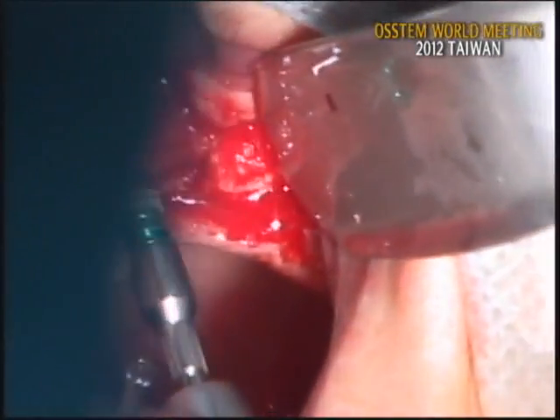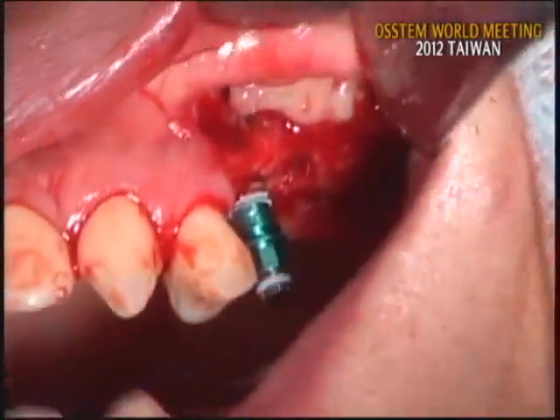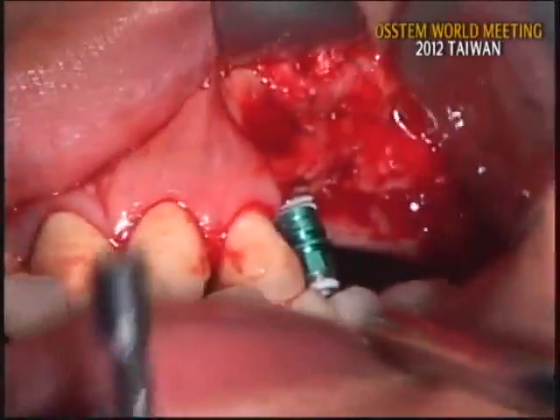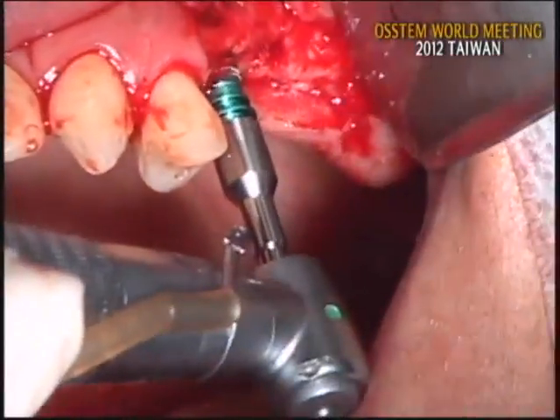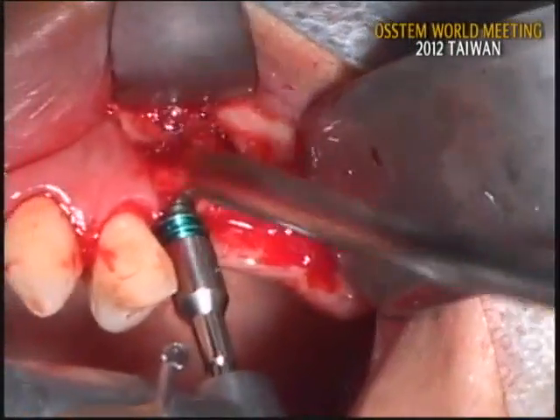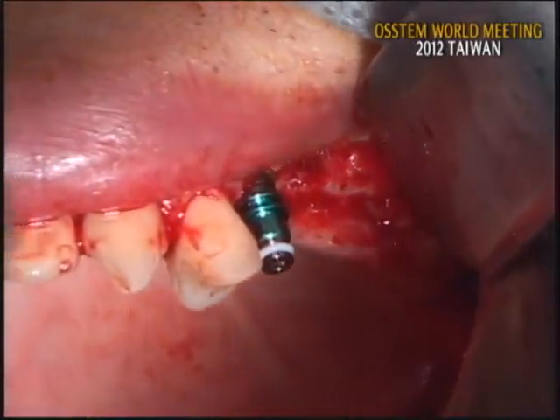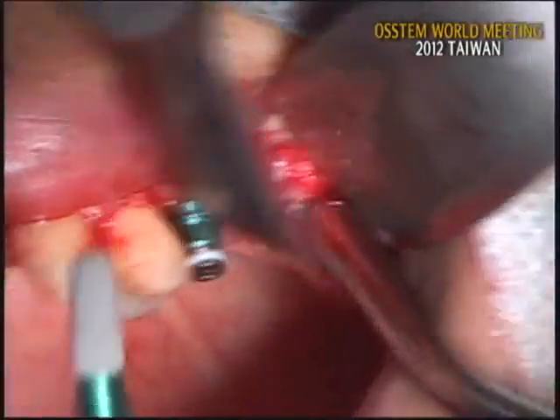Okay. Torque is not bad. Close. Okay, good. Open, please. I think torque is very nice. One more. Yeah, this is 4.5 by 10 millimeter.